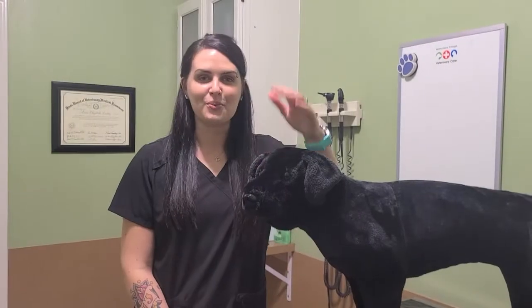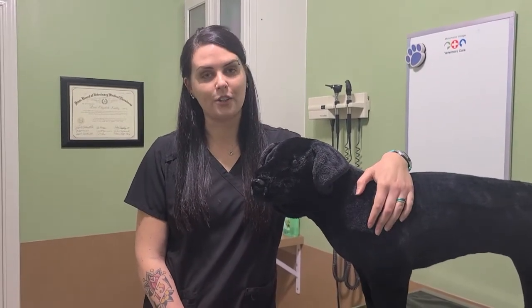Hi, my name is Karen. I'm the lead veterinary technician here at Manchak Village Veterinary Care. Today I'm going to talk to you about the Freestyle Libre that you can use for your diabetic pets. This is Rover. He's my demo dog. He has diabetes, so he's going to help us understand what the Freestyle Libre is and how it works.